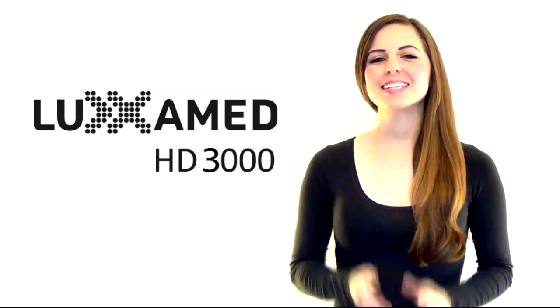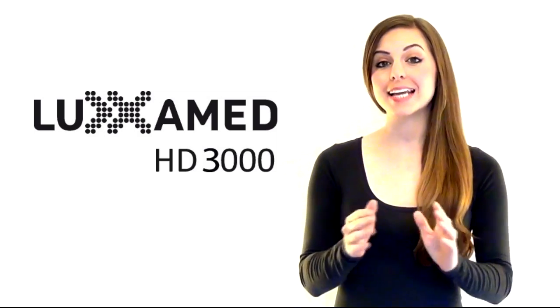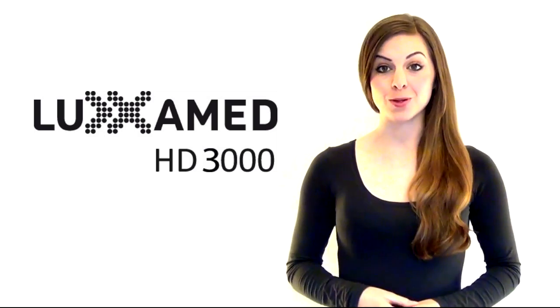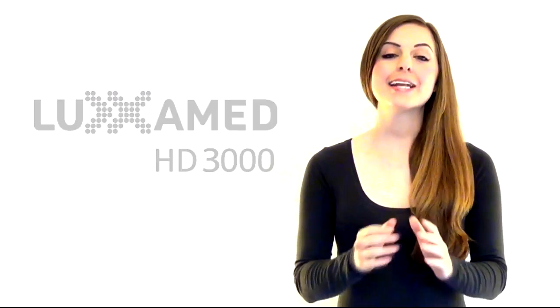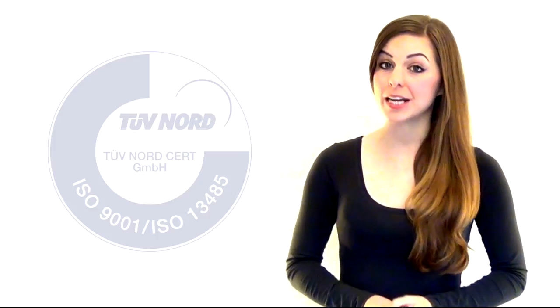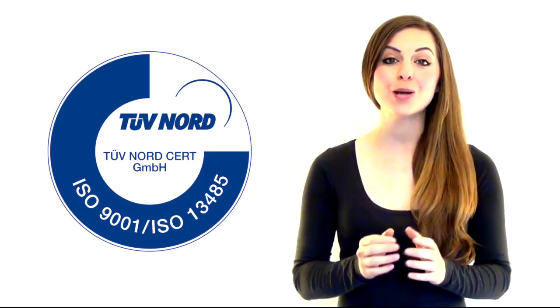The Luxamed HD3000 is the latest mobile model from the Luxamed brand. It combines the highest standards of clinically tested quality with total mobility.